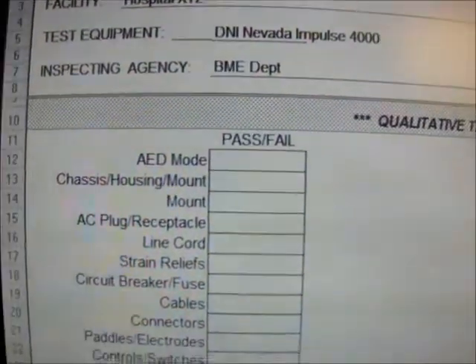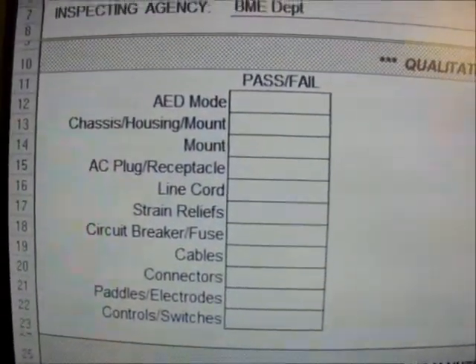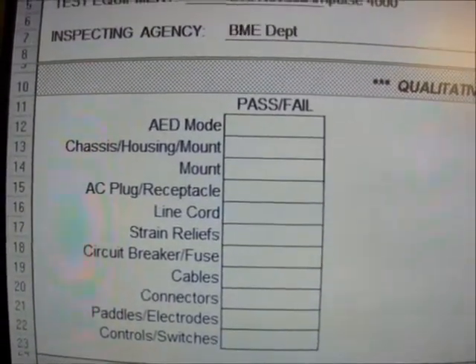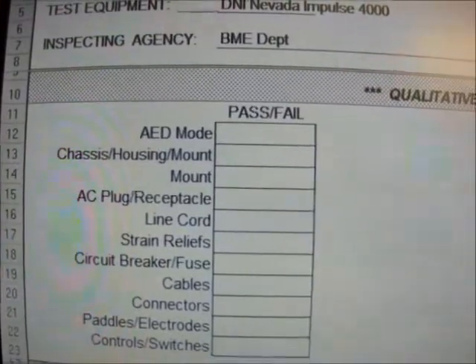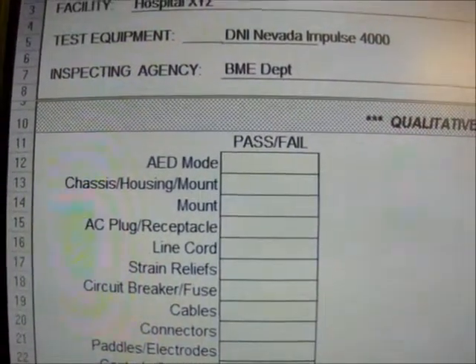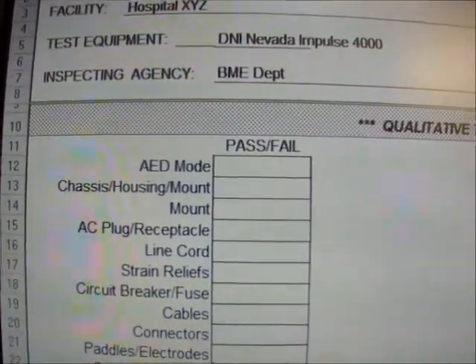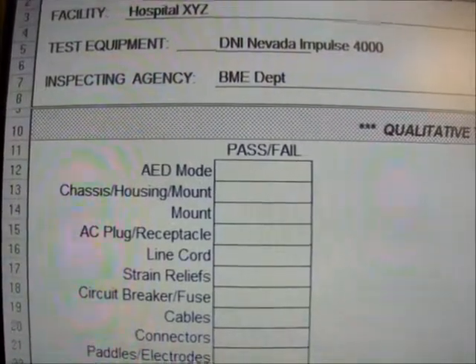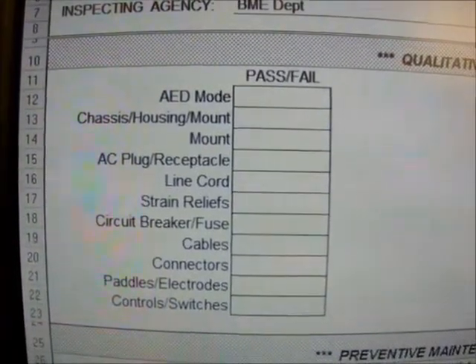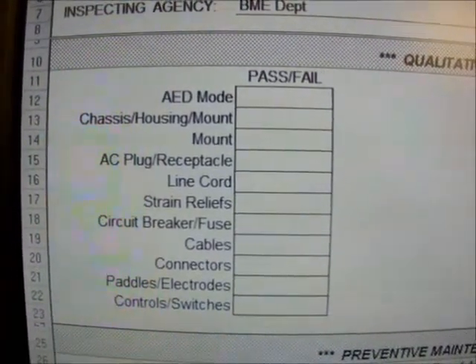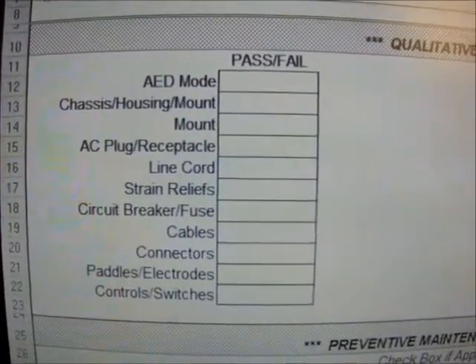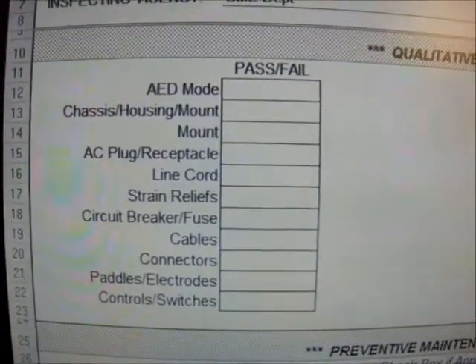Moving along to the qualitative tasks. These are pass or fail tasks, such as AED mode. The following are observations of the AED prompts — both voice and text simulations, such as shock advised, stand clear, perform CPR — all based on the factory default settings for AED mode. We are also checking the chassis, housing mounts, AC plug receptacles, line cord, strain reliefs, cables, connectors, paddle, electrodes, control switches, and summary reports.